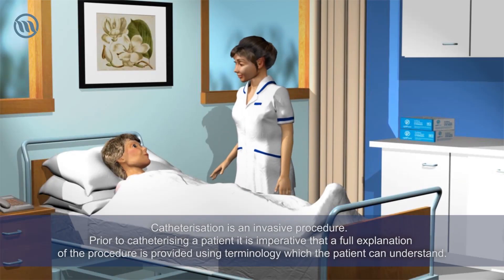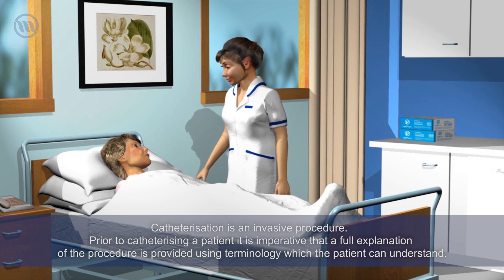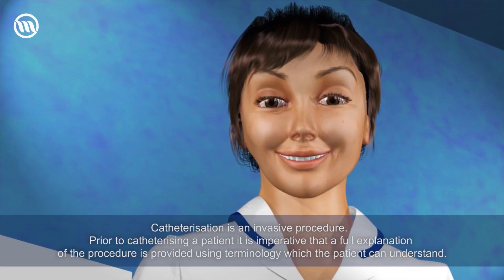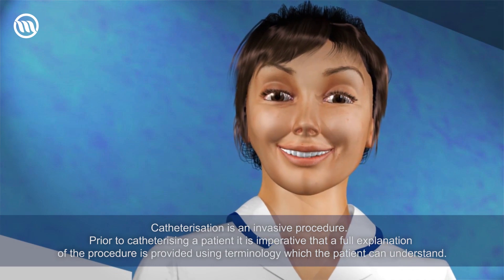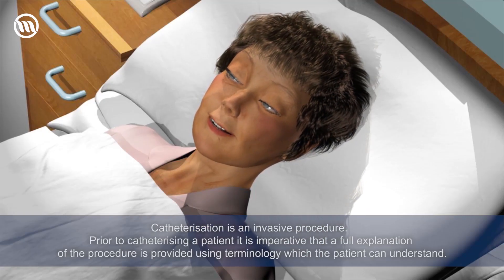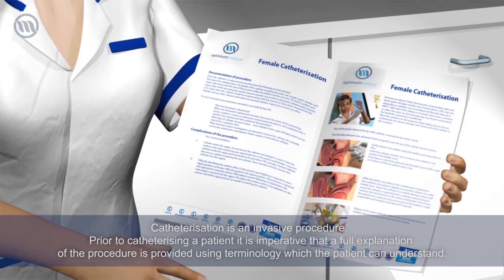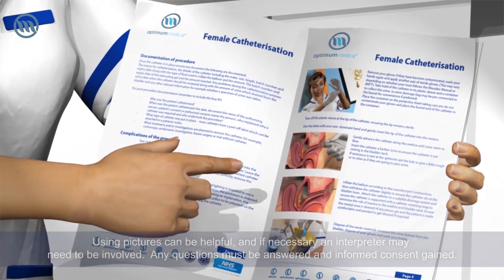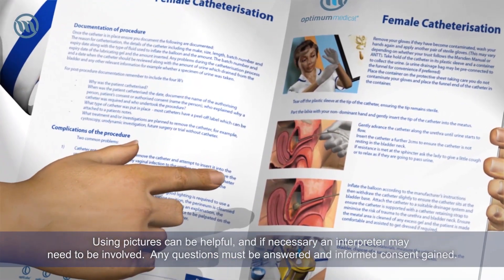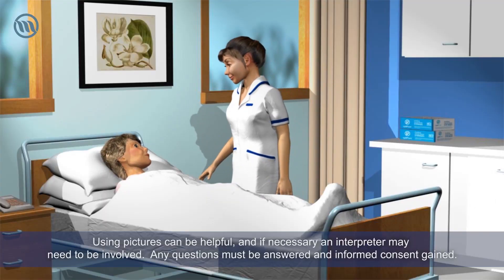Catheterization is an invasive procedure. Prior to catheterizing a patient, it is imperative that a full explanation of the procedure is provided, using terminology which the patient can understand. Using pictures can be helpful, and if necessary, an interpreter may need to be involved.